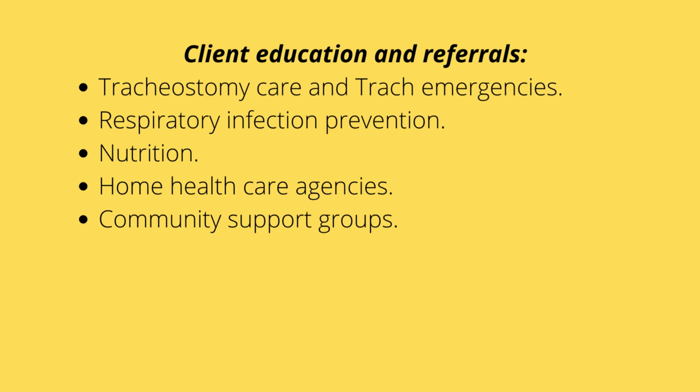Suctioning for this client is PRN. It's not on a rotational schedule. It's as per MD orders. We always use surgical asepsis for trachea suctioning, as we talked about. We assess respiratory distress. We always start from the patient. If we have an issue, we go from the patient to the machine. Always remember that. And we provide trachea care every 8 hours and PRN.